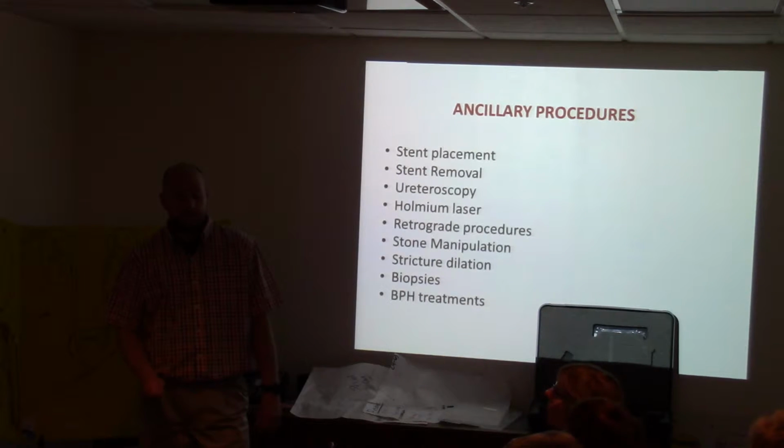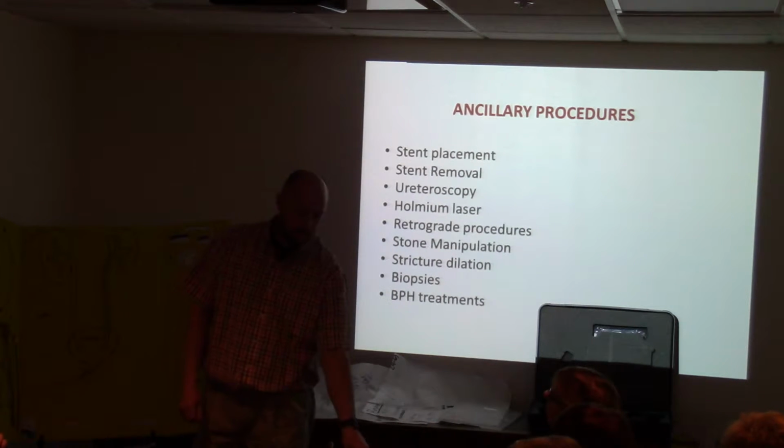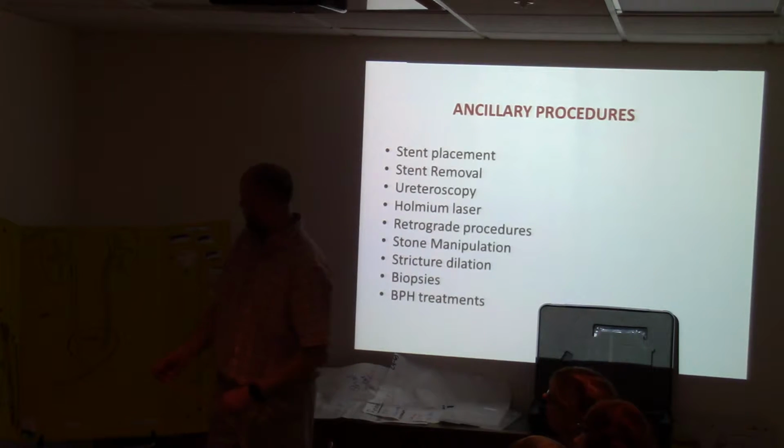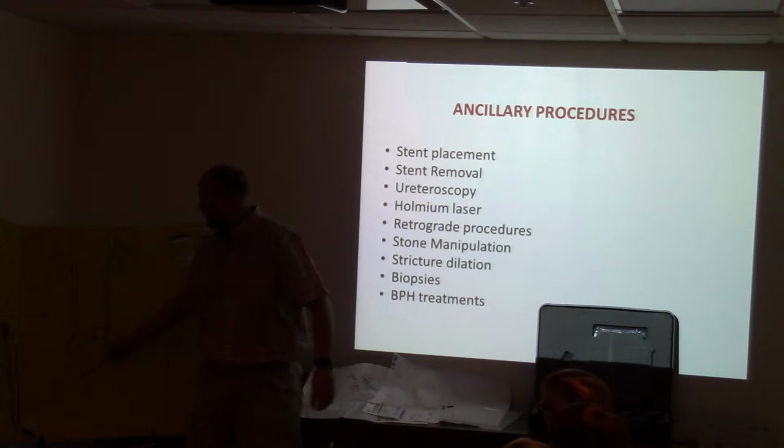So you have to insert a catheter to do a retrograde. Sometimes you do it, sometimes you don't. Sometimes they'll put a catheter in just to push a stone into a different place, like that would be with manipulation. So they'll put the catheter in to push that stone where they want it, so they don't inject contrast. So they'll push that stone up. Sorry, you just can't see. And they try and work it, and they'll push it until they get it in the kidney.